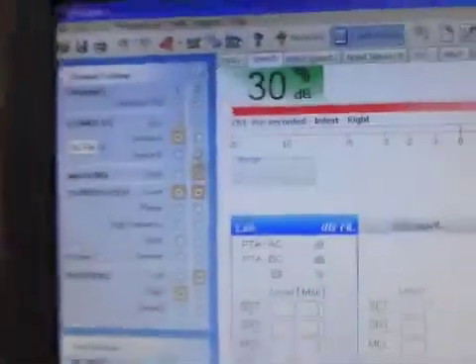So exactly like you're looking at this, unfortunately it's backwards. This is the left speaker, this is the right speaker in the sound field. I know this is blue and this is red, but in the sound field, left speaker, right speaker. So I'm going to set this up right now that source A, which is speech, is going to be in the left speaker. Source B, which is noise, is going to be in the right speaker. Again, this is in the sound field.